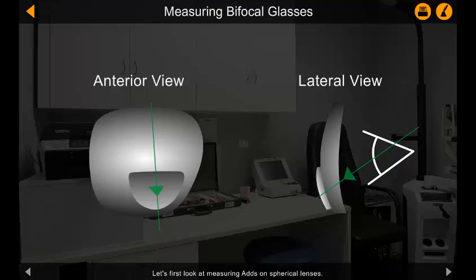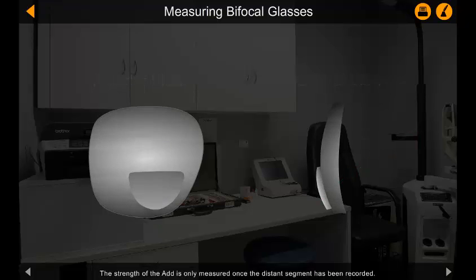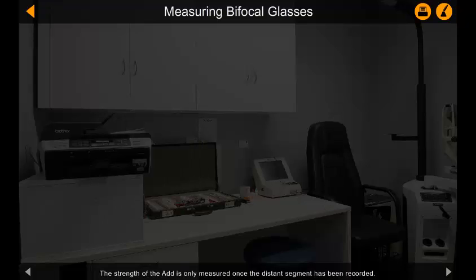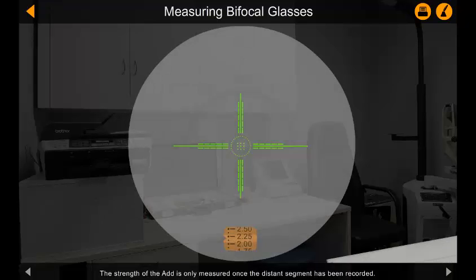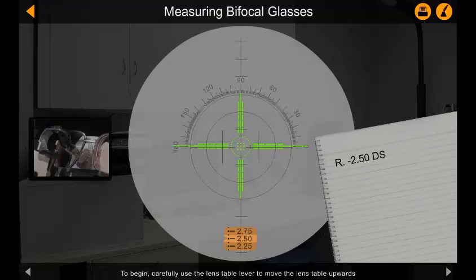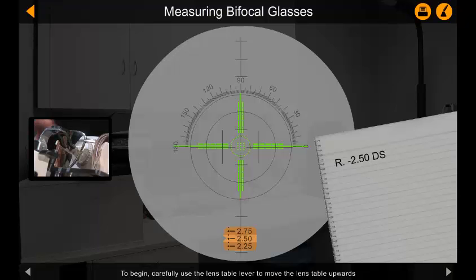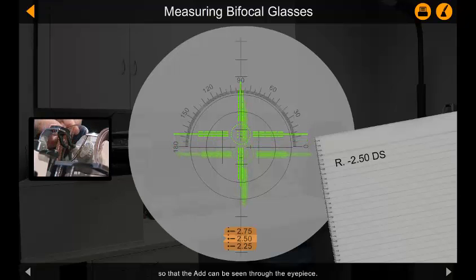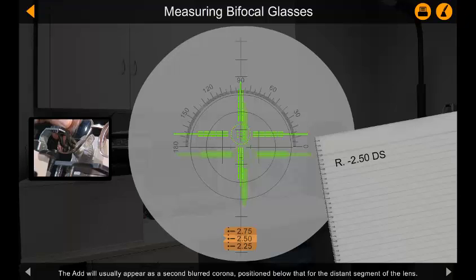Let's first look at measuring adds on spherical lenses. The strength of the add is only measured once the distance segment has been recorded. To begin, carefully use the lens table lever to move the lens table upwards so that the add can be seen through the eyepiece. The add will usually appear as a second blurred corona positioned below that for the distance segment of the lens.